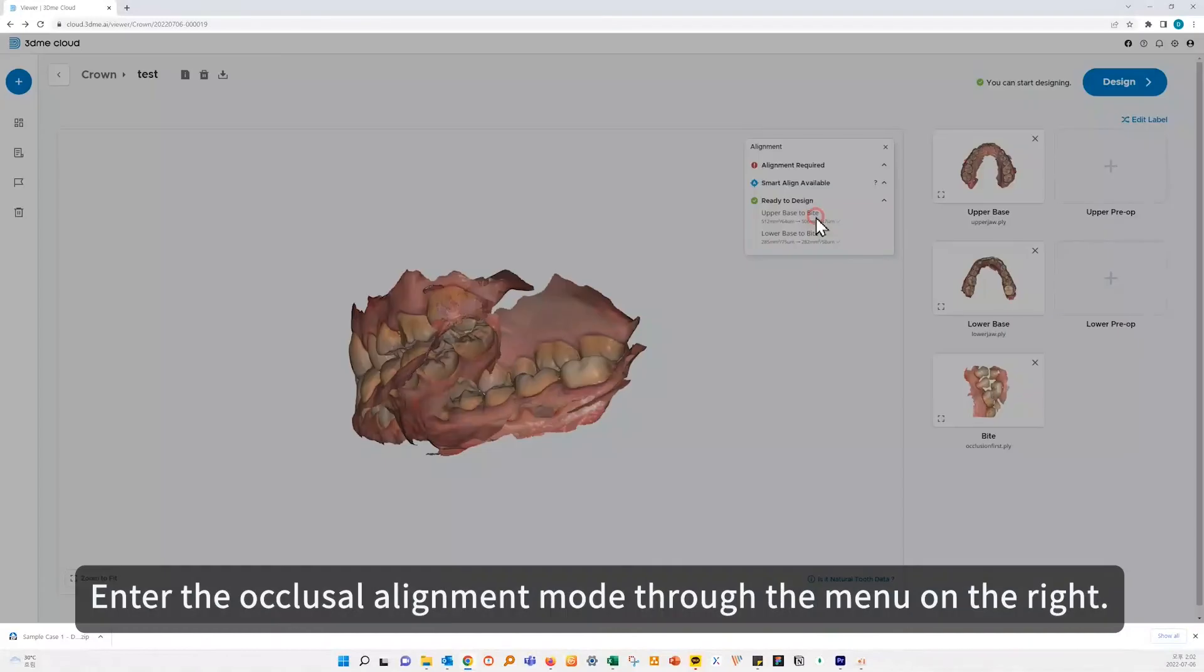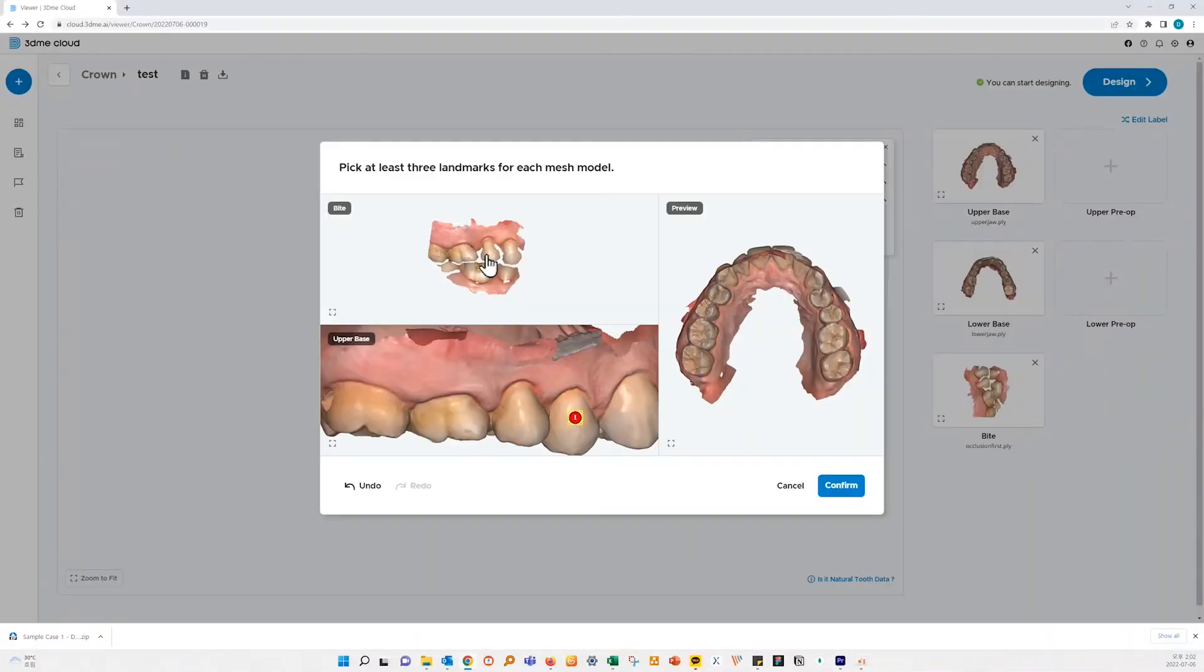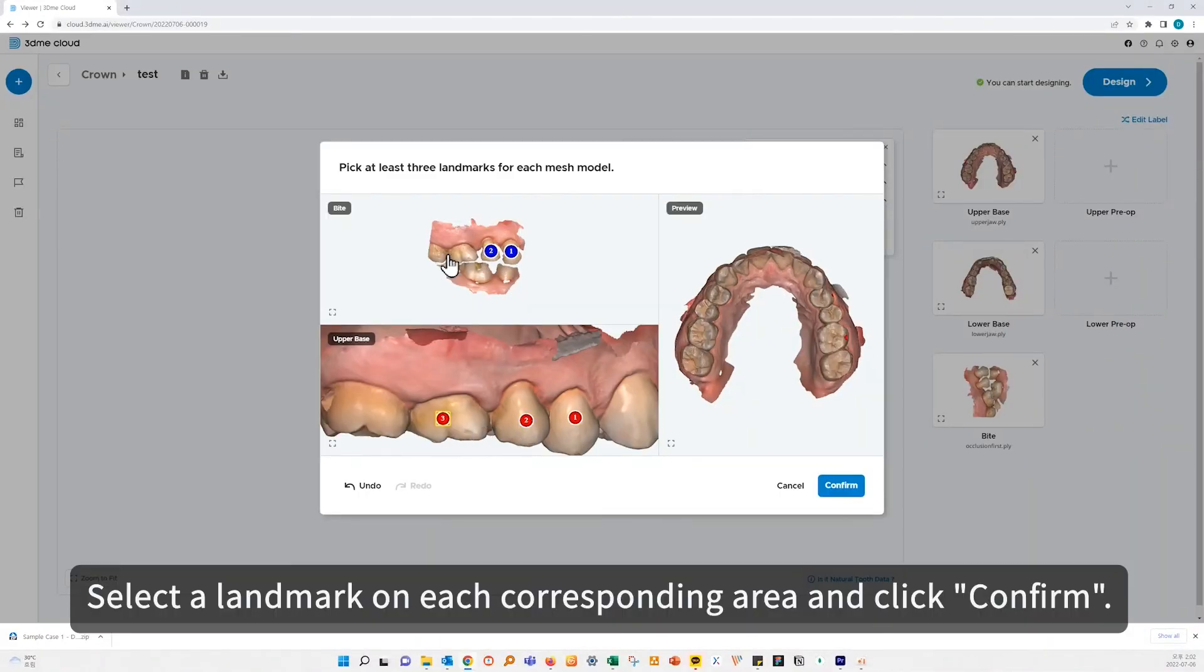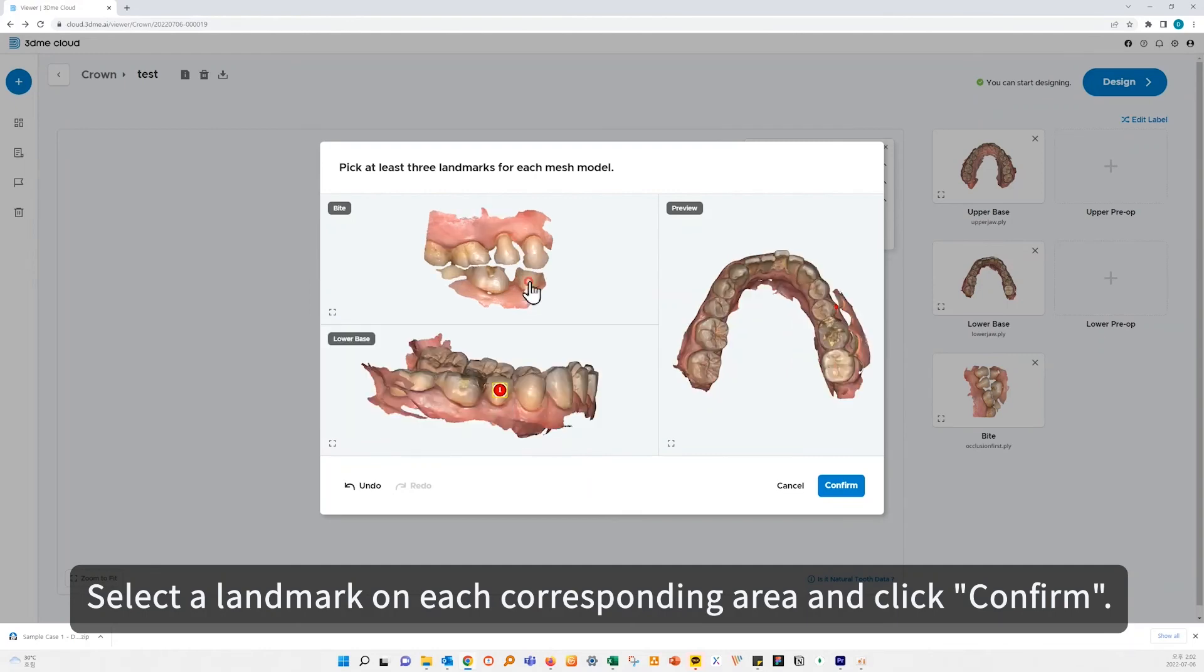Enter the occlusal alignment mode through the menu on the right. Select a landmark on each corresponding area and click confirm.